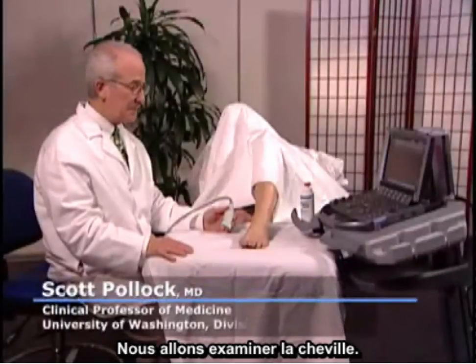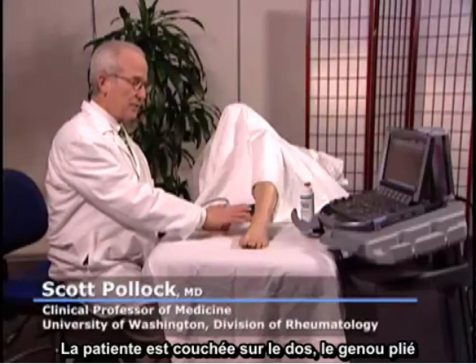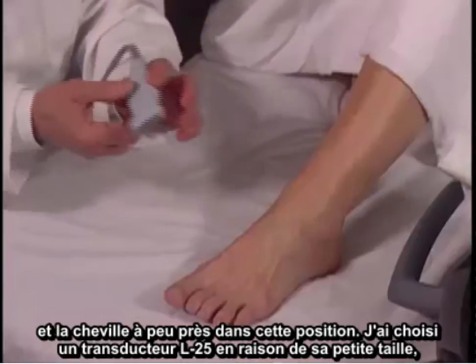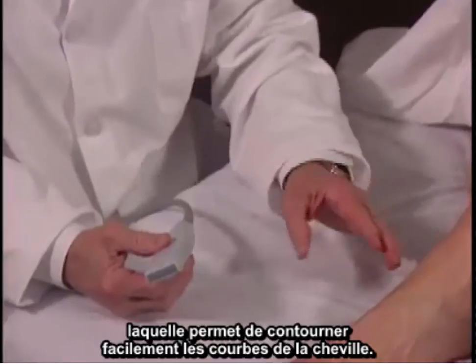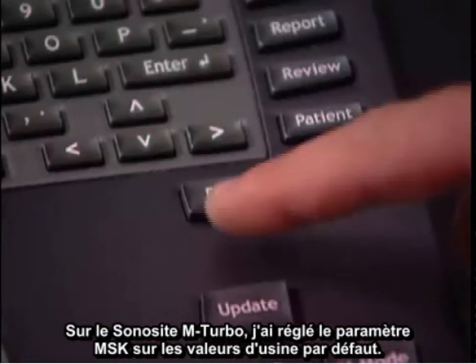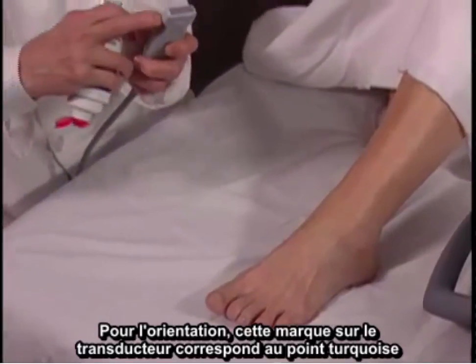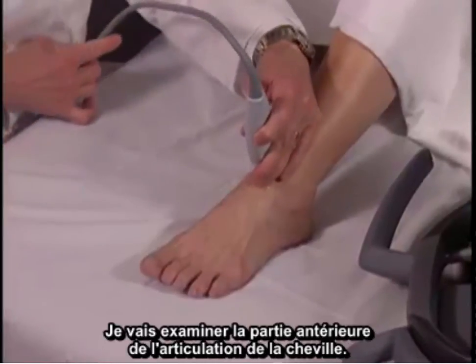We're going to examine the ankle. The patient is lying on her back with her knee flexed and ankle in approximately this position. I've selected an L25 transducer because it has a small footprint and it's easy to get around the curves in the ankle. On the Sonosite M Turbo, I've set the factory preset for MSK. For orientation, this mark on the transducer corresponds to the turquoise dot on the upper left portion of the screen.